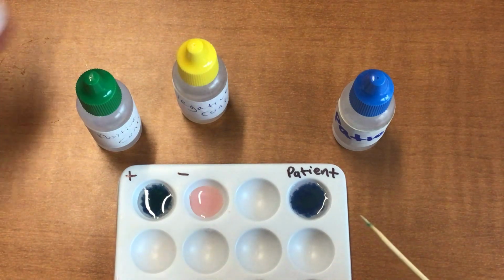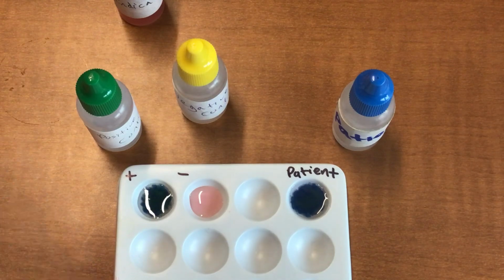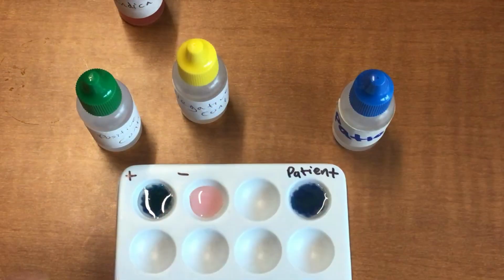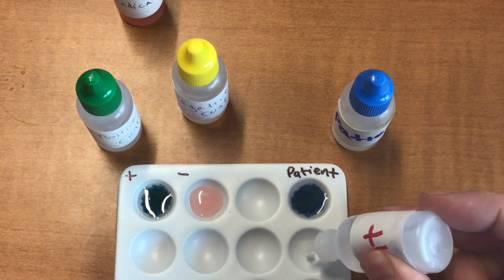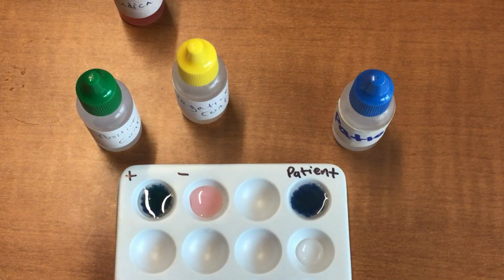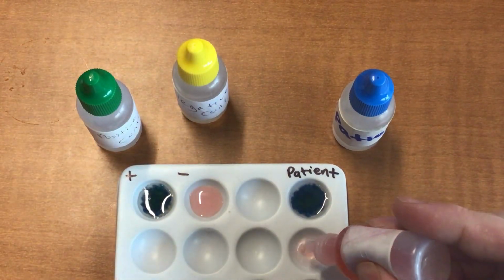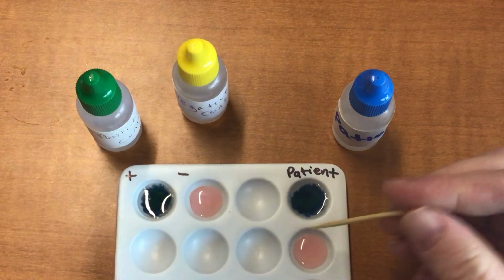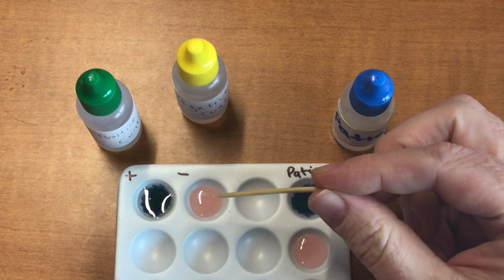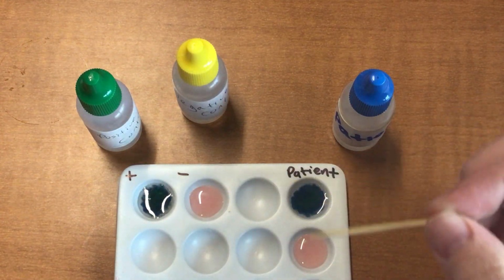Now, what would it look like if we were wrong? If it wasn't salmonella that we were testing for, this is an example of a patient that does not have salmonella, and this is what that would look like. So let's say we're testing a patient, and we think this patient has salmonella. Put the indicator in there. And you can see this patient here, patient number 2, compares to the negative. So this patient has salmonella. This patient does not. And we can literally just compare it.